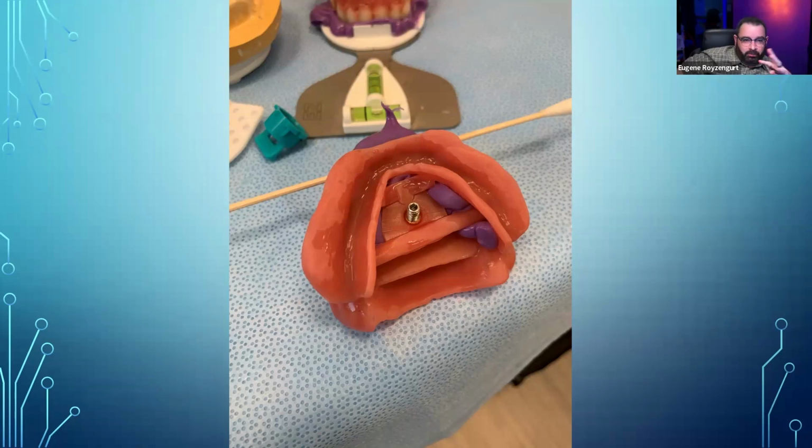do proper impressions, obviously, then do wax rims, maybe even with a Gothic arch tracer, do a posterior setup to verify that you have good occlusion, and then do anterior extraction and do final.